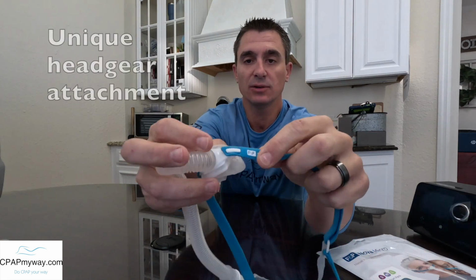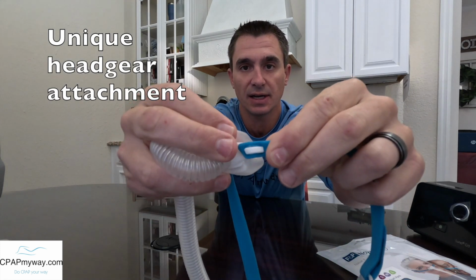The attachment of the headgear is pretty interesting as well. You'll see it kind of goes in a little bit of a notch there, and to get it off, you kind of pull, flip it under, and it comes right off. And then to put it on is the same way, right? You just hook it in the end there. You can see where it hooks on, and then just pull it around, snap it into place.